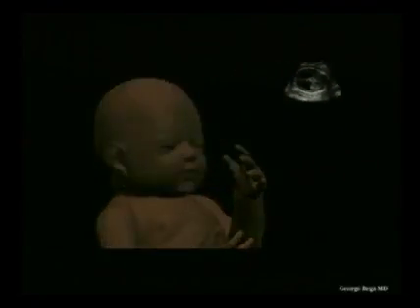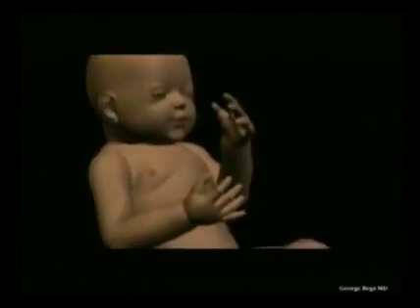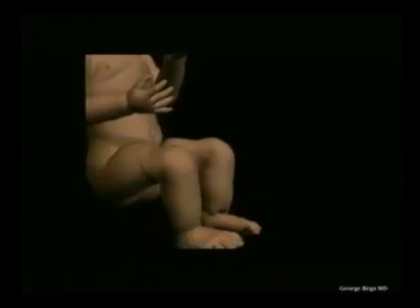The standard planes are planes that have been over the years found to be accessible. We can have access to these planes by 2D ultrasound, as the 2D beam can cross-sectionally cut parts of the anatomy. So again, the so-called 2D standard planes are planes that 2D ultrasound is good at. It has been seen that over the years we are most of the time capable of obtaining them. And no doubt about it, we've been doing a great job using 2D ultrasound for clinical reasons.